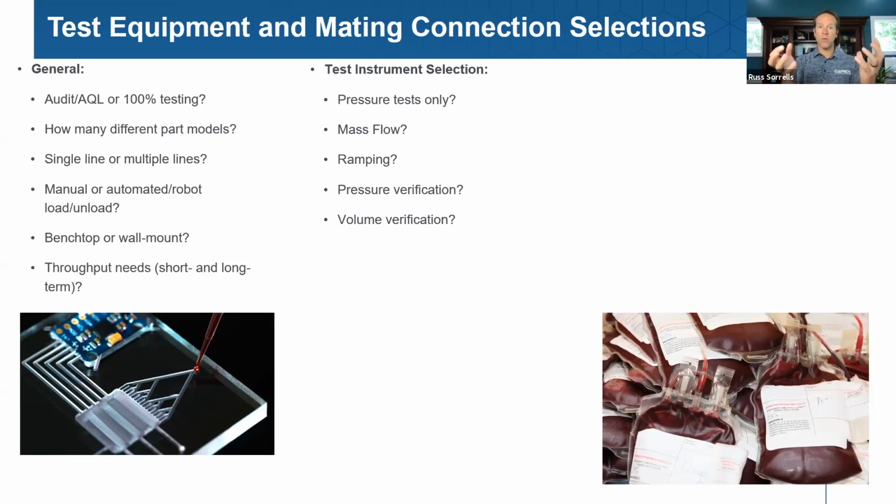And so we know with the end pressure what amount of air went from our known volume into our test part, and that pressure that's left we can then use to determine the volume of the part. So just to explain how we do a volumetric fill type of test and verification, that is one of the common ways that we do it.